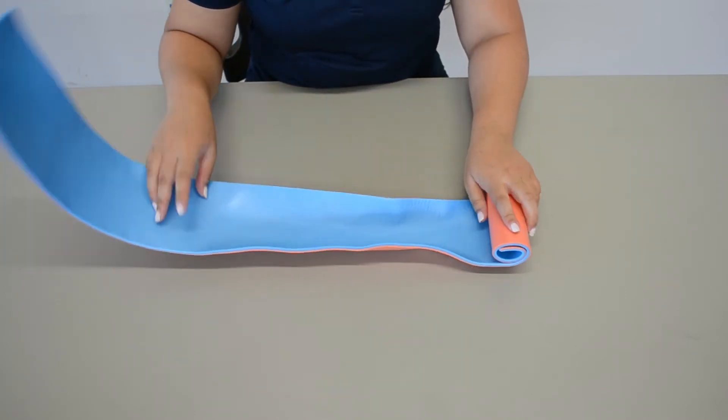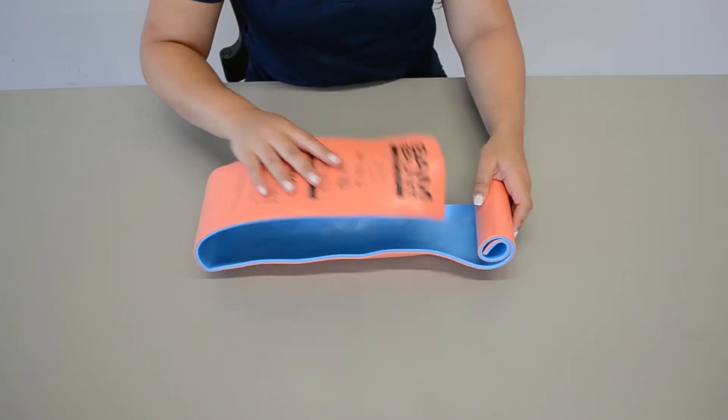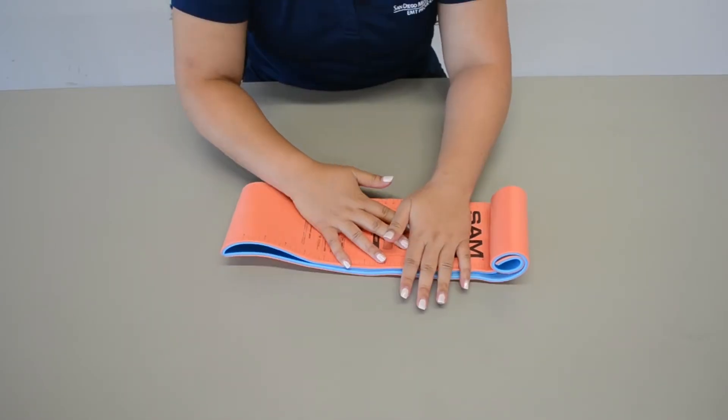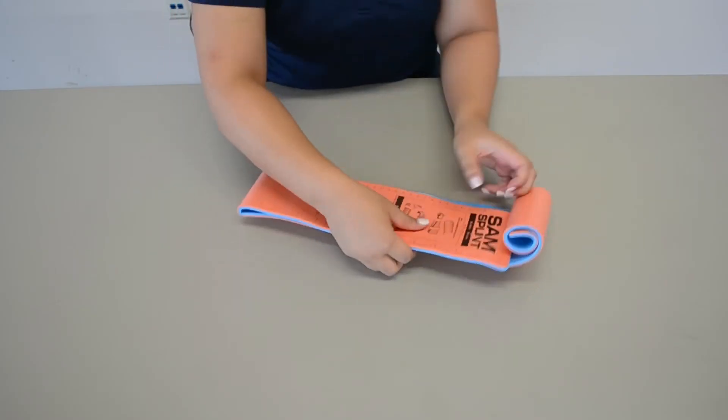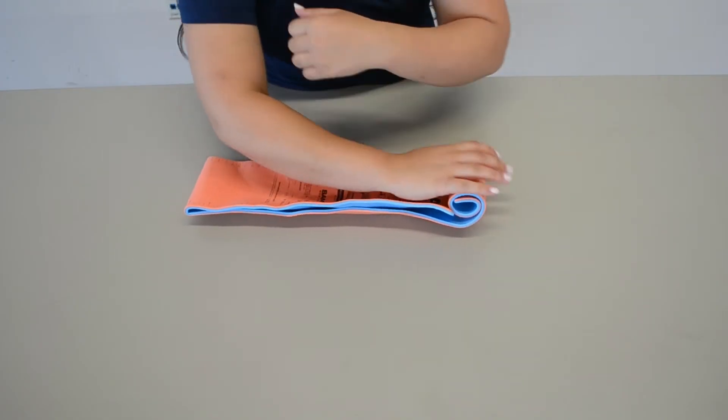The other technique is the variation of a sugar tong technique. So say you can't go over the patient's arm, you can also have this go on the bottom like that, and then again create a tunnel for the arm to go on, and so that way you can wrap.